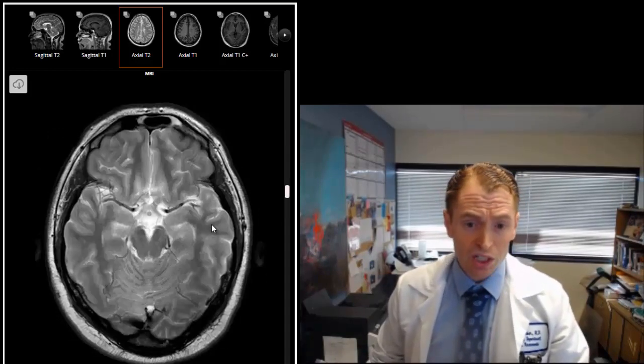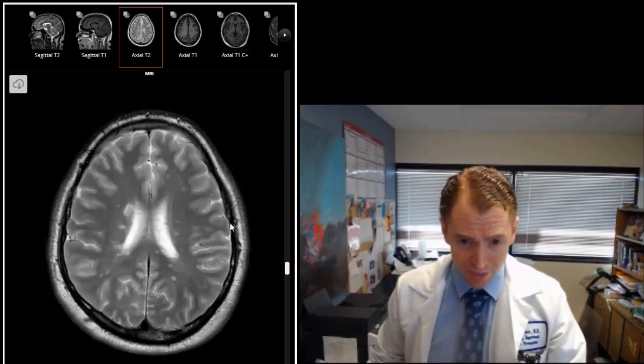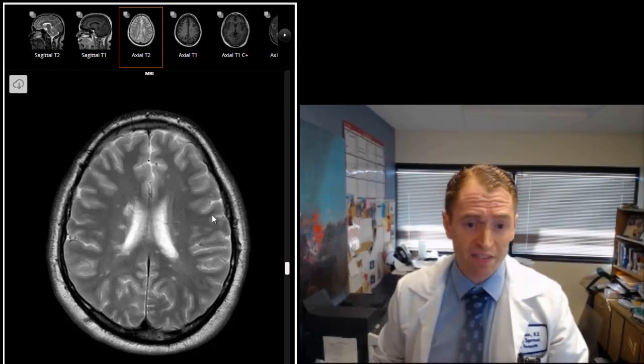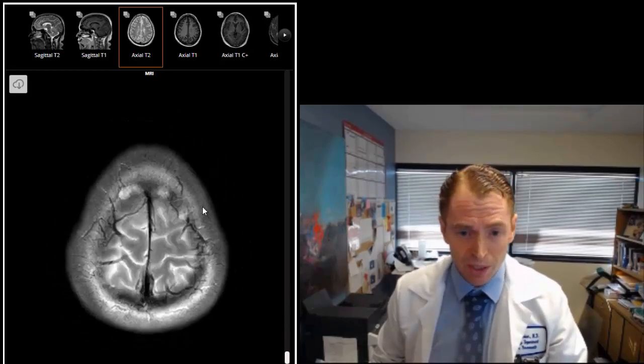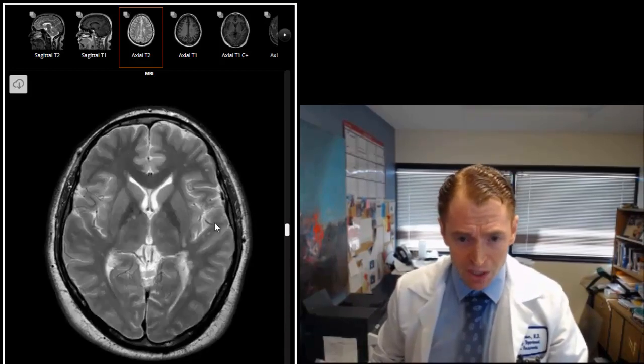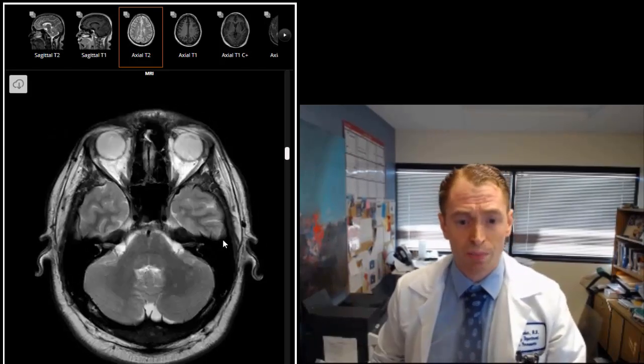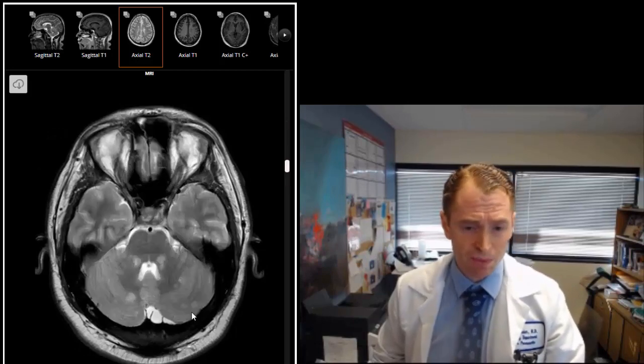Now I don't know the symptoms but believe it or not, with this MRI this man could easily be a marathon runner and a CEO with five kids and have virtually no symptoms. Now probably he has some symptoms based on some active lesions in the spinal cord which I'll show you a little bit, but surprisingly he may have relatively few symptoms.